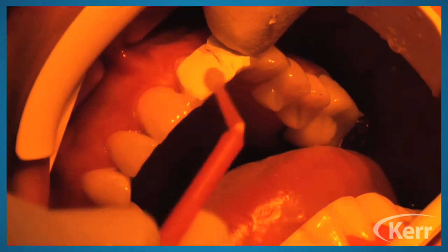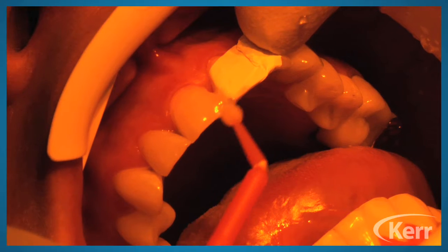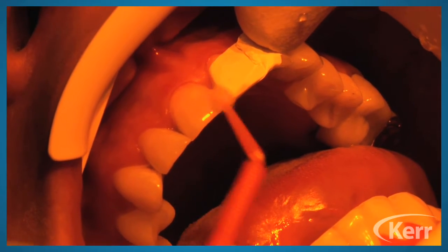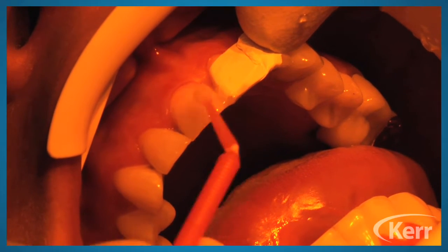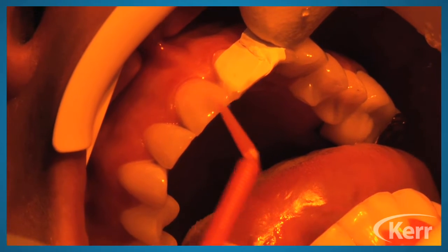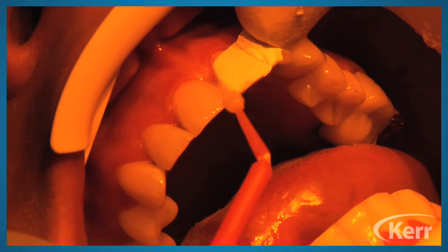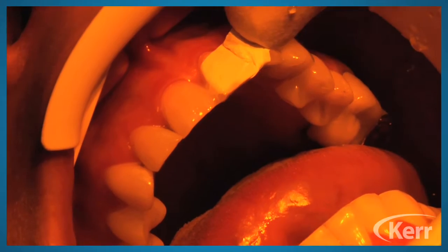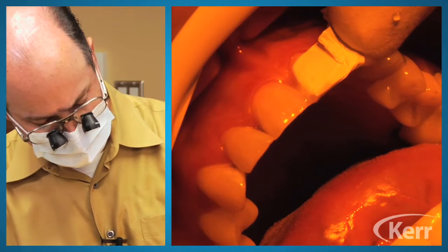And I usually use 2 or 3 coats. So I like to use 2 or 3 coats, and you can watch that I am in fact rubbing, scrubbing, agitating. You choose the word. Agitation is what most of us probably put. That's the word in the literature most of the time would be agitate. And even though we're mostly, as I said, into enamel, we only maybe had a tiny bit of dentin exposed here, I still like to agitate this well. And so we get good adaptation, good flow into the enamel microstructure here, the etch pattern.